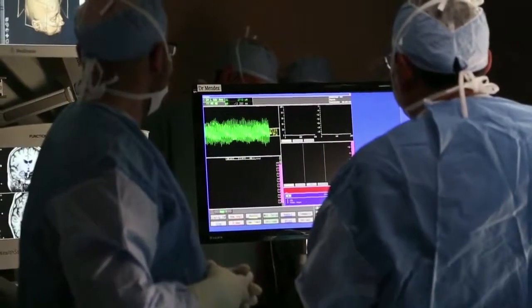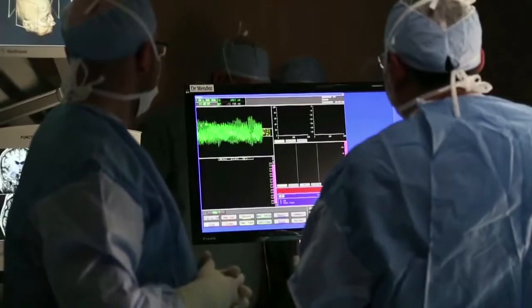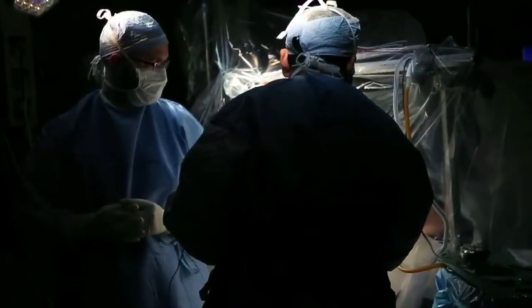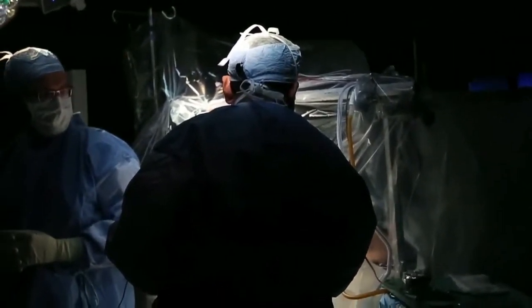As we are putting the electrode, we are actually going to record from the cells of her brain. She's going to be awake during the procedure. Everything is going well, Susan. Okay? She says okay. Okay. And each cell group has its own voice. So we know exactly where we are. And that's why she's awake, because we need the cells to be awake so we can record from them.